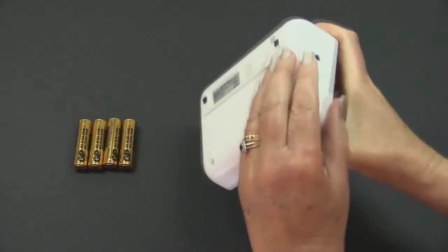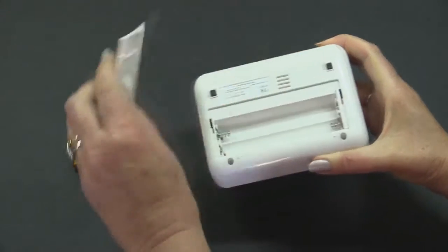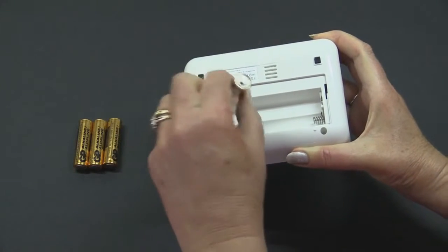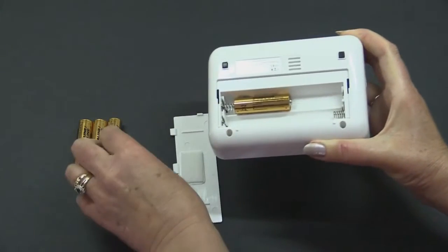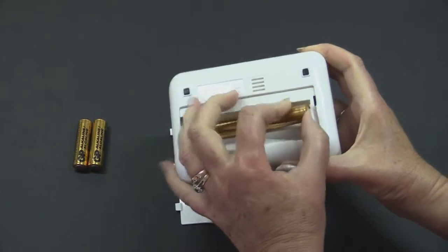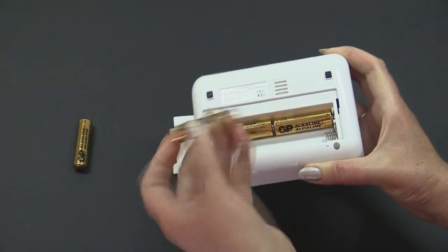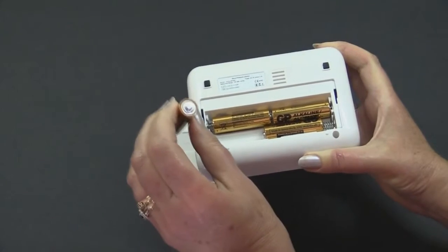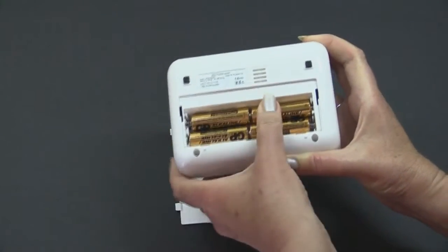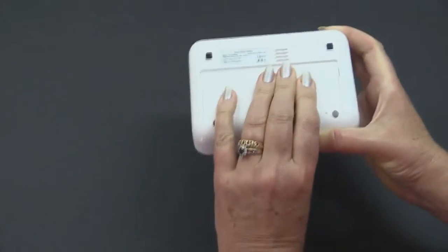First, you must insert the batteries. To do this, remove the cover by sliding it upwards towards the centre of the monitor's body. This unit uses four batteries, two of which are inserted together in the same direction with their flat negative terminal facing against the spring. The other two are inserted in the opposite direction, again with their flat negative terminal facing against the spring. Give them a quick twist to ensure a good contact and replace the cover by sliding it back into place.